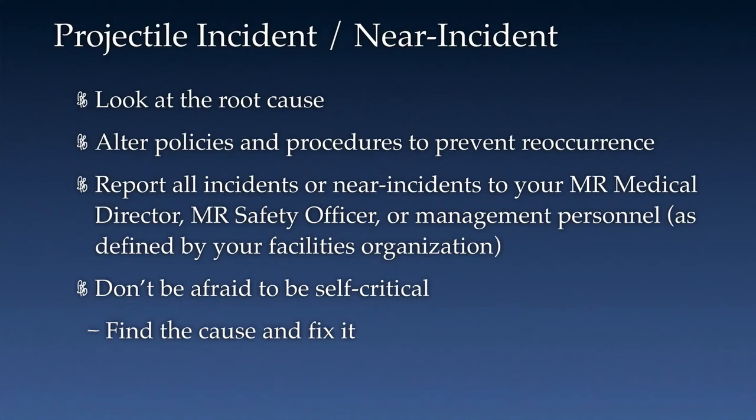All incidents or near incidents should be reported to your MR medical director, MR safety officer, or management personnel as defined by your facility's organizational structure. Don't be afraid to be self-critical when an incident or near incident occurs. In order to create and maintain a safe MRI environment, it's important to find the root cause of an incident and just fix it.